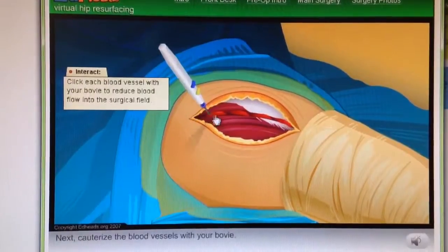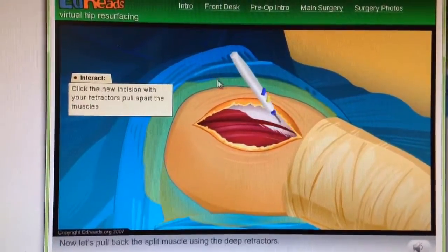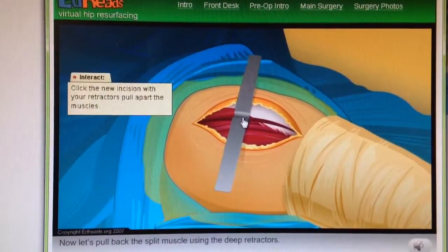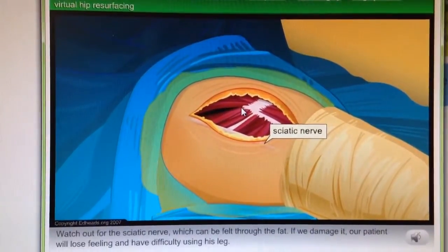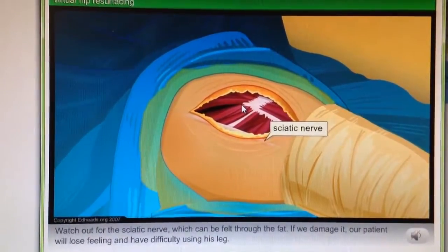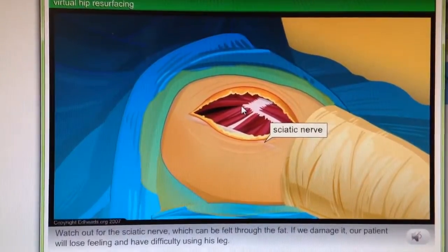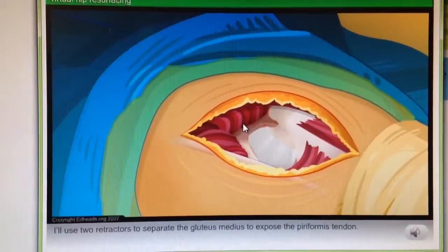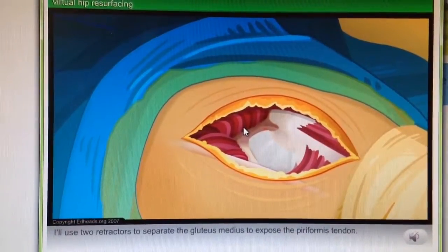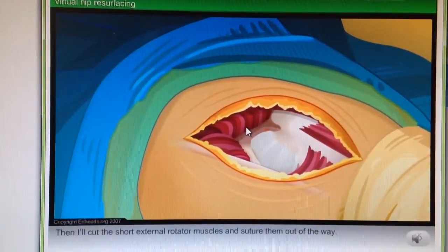Next, cauterize the blood vessels with your bovie. Now let's pull back the split muscle using the deep retractors. Watch out for the sciatic nerve, which can be felt through the fat. If we damage it, our patient will lose feeling and have difficulty using his leg. I'll use two retractors to separate the gluteus medius and expose the piriformis tendon, then cut the short external rotator muscles and suture them out of the way.